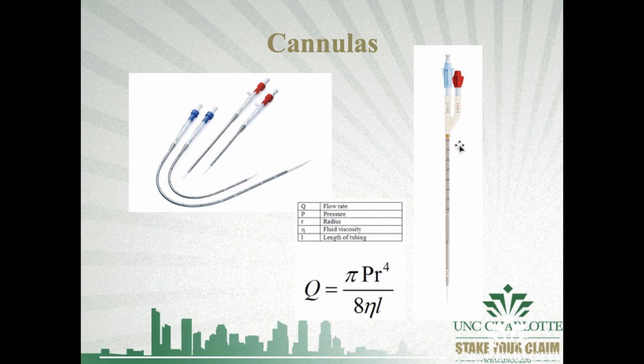So patients with these kind of cannulas can walk, they can rehab, they can do a lot of fun stuff, but they're expensive, and the placement's somewhat difficult. So often you do need fluoroscopy to insert these. These cannulas are usually inserted peripherally, as is that, but this can be in your IJ, and you can have a return into your fem vein right here, or we'll get into that in a second. But these generally can be inserted with ultrasound or actually just percutaneously as if you're inserting a central line.